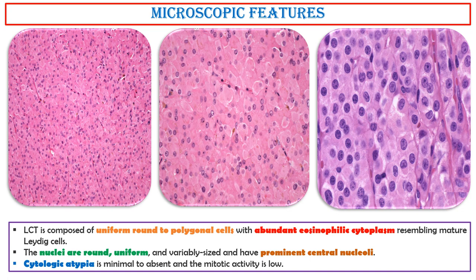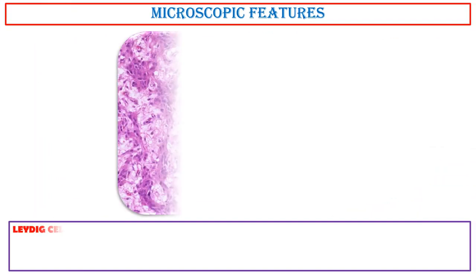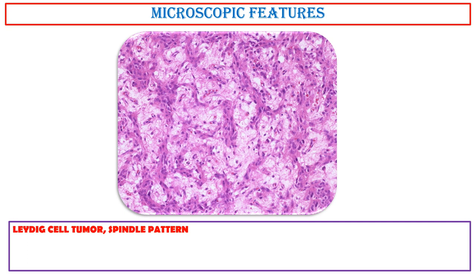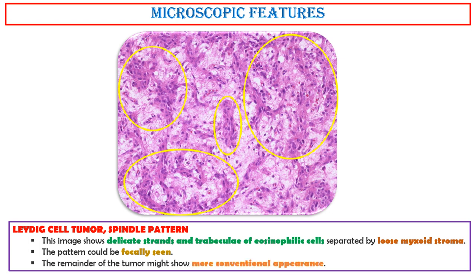Cytologic atypia is minimal to absent, and the mitotic activity is low. Leydig cell tumor spindle pattern: this image shows delicate strands and trabeculae of eosinophilic cells separated by loose myxoid stroma. The pattern could be focally seen; the remainder of the tumor might show a more conventional appearance.